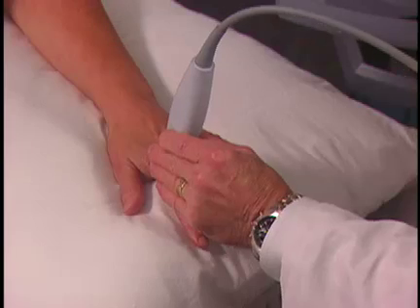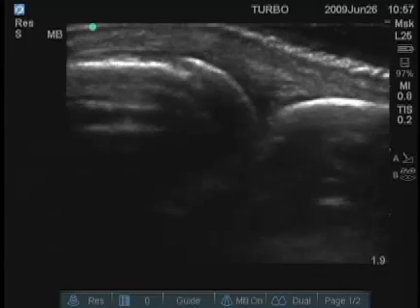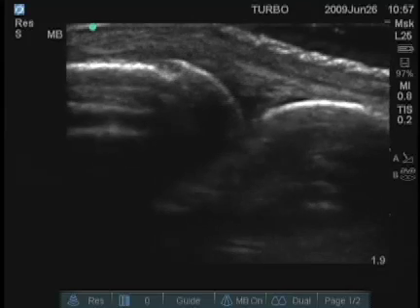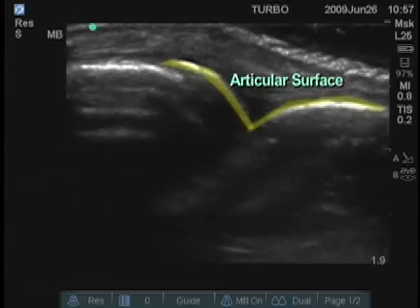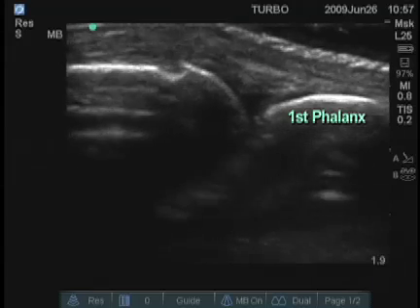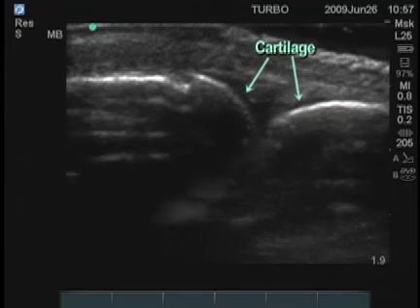We'll look longitudinally over the second MCP first and see the skin surface on top and the bones. This is proximal — so this is the end of the second metacarpal. Here's the articular surface, and then here is the proximal portion of the first phalanx. The black anechoic surface here is cartilage, and there's some cartilage here. This is a normal joint structure at the second MCP.